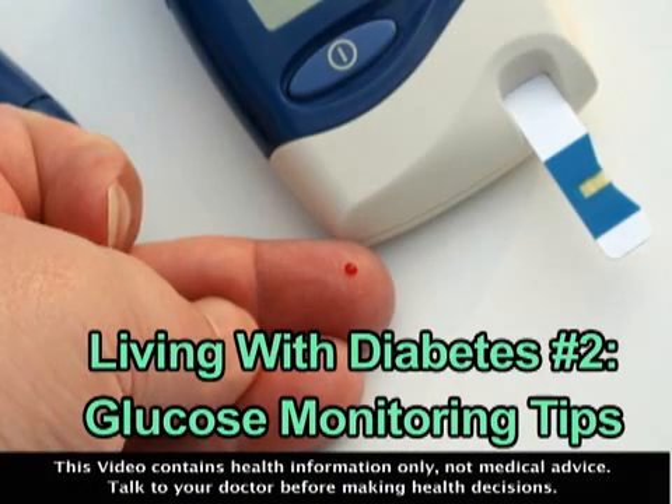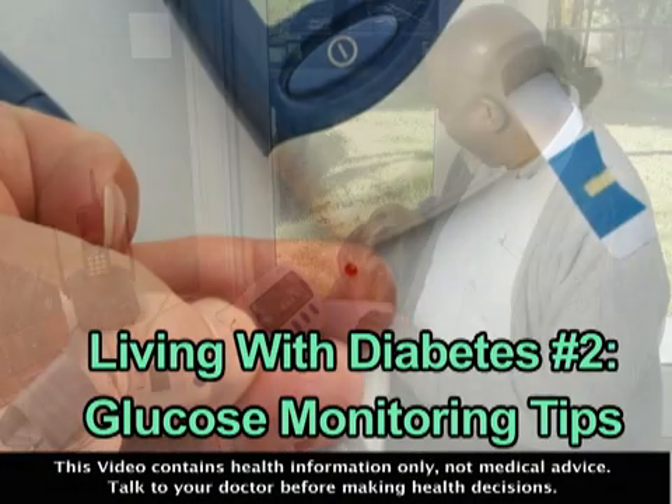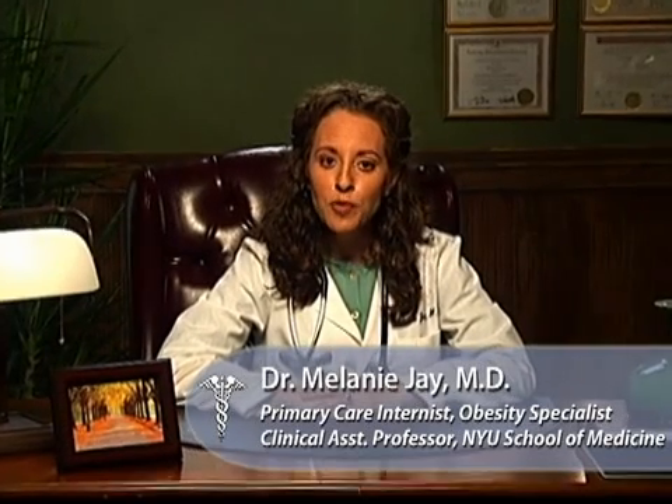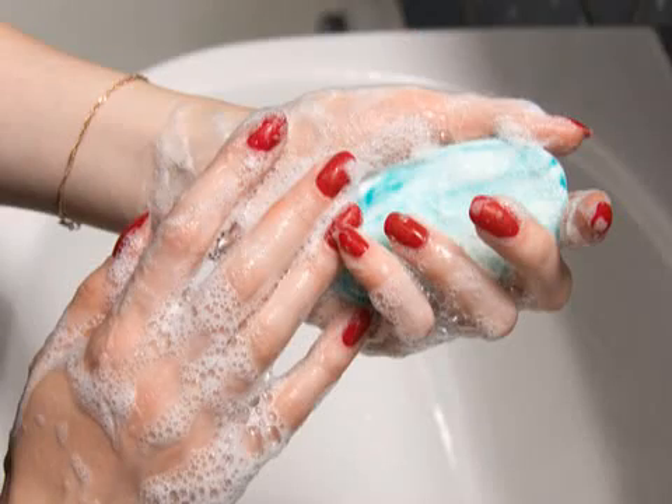No matter what type of diabetes you have, it's imperative to monitor your blood glucose. Here are some tips to make that easier. Diabetics know that they must use glucose meters to check the levels of sugar in their blood. This important routine helps detect the abnormal blood sugar levels that can cause serious illness, comas, or even death.